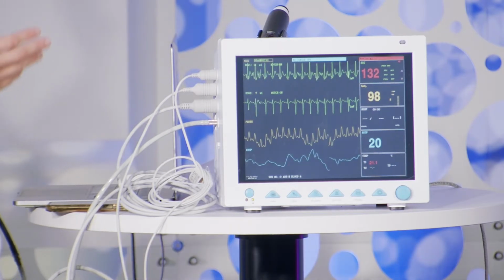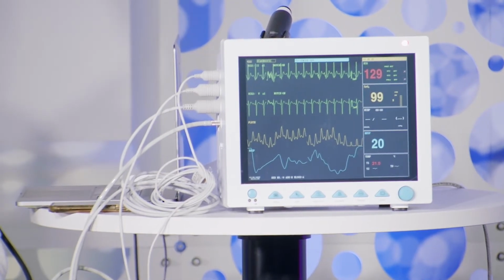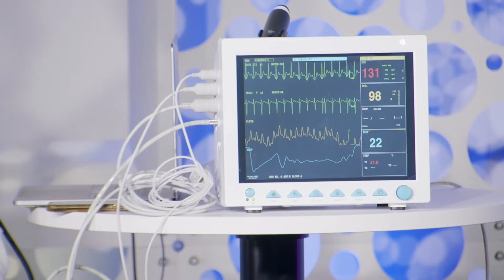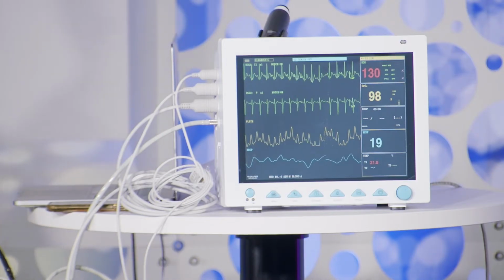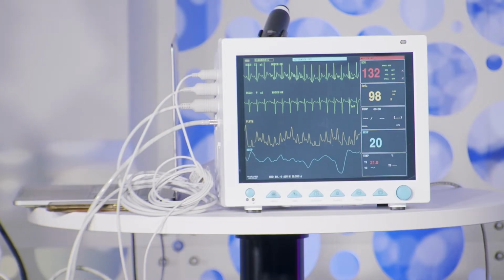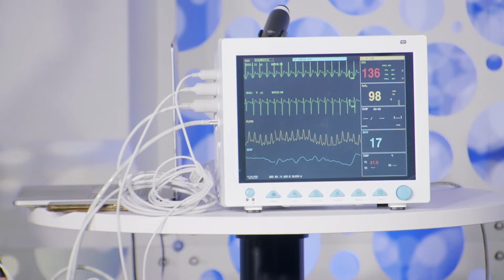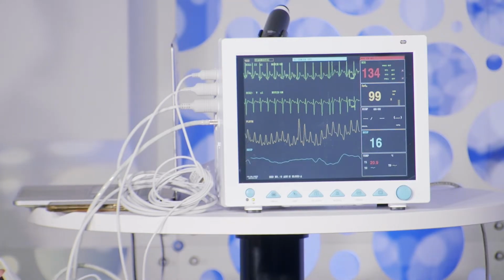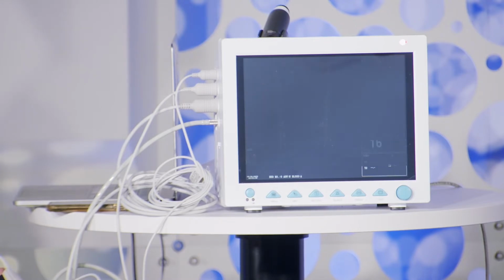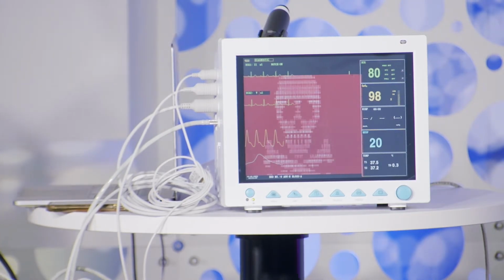So one of the attack vectors that we thought would be interesting to show is what if we want to ransomware the device. And we actually prepared such a scenario. All I need to do is click on the ransomware button, and hopefully it's going to work. So the backdoor needs to pull the payload from the CNC. Let's see. Something is going on here. Hopefully it's going to work. Okay, now, yeah, now we have a ransomware on the device.